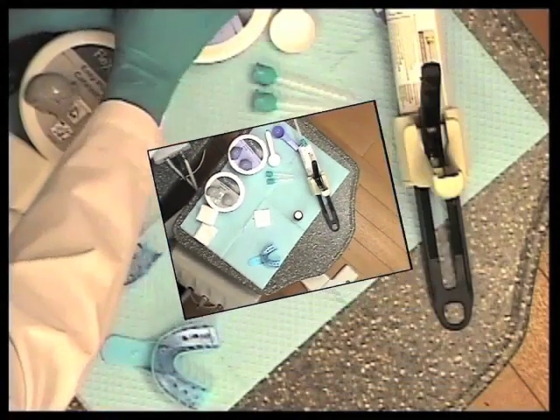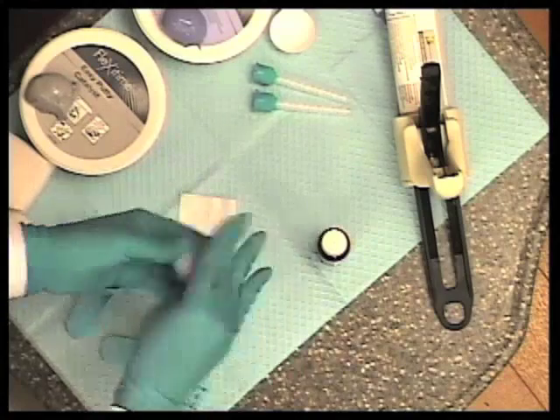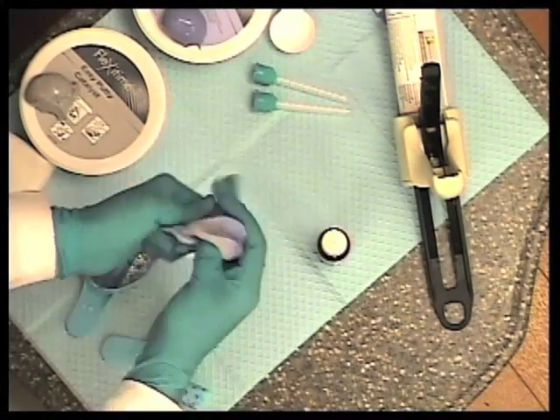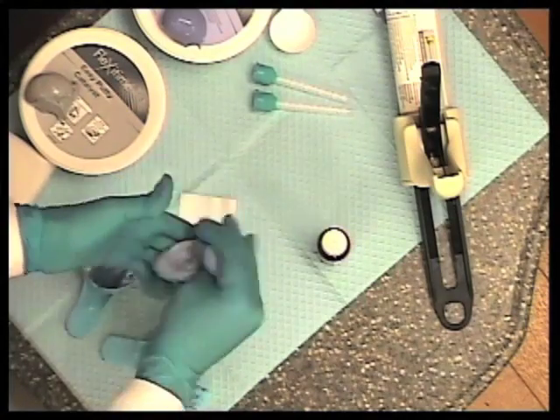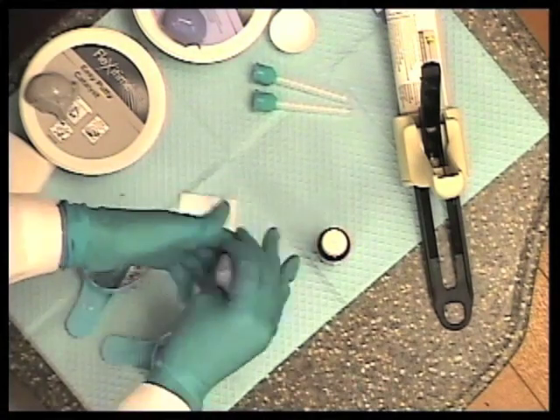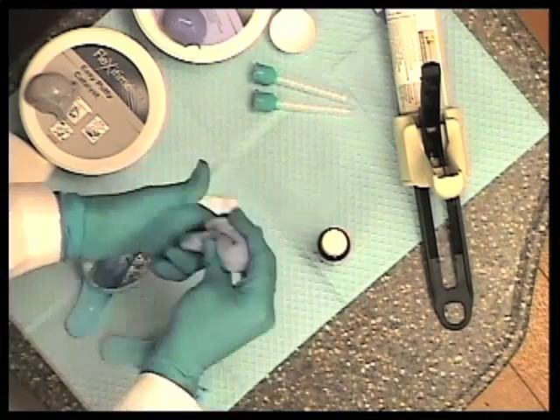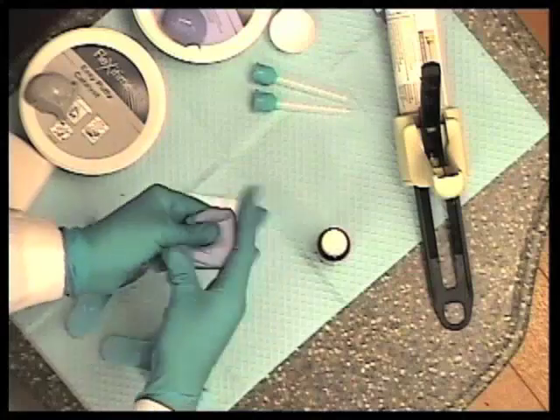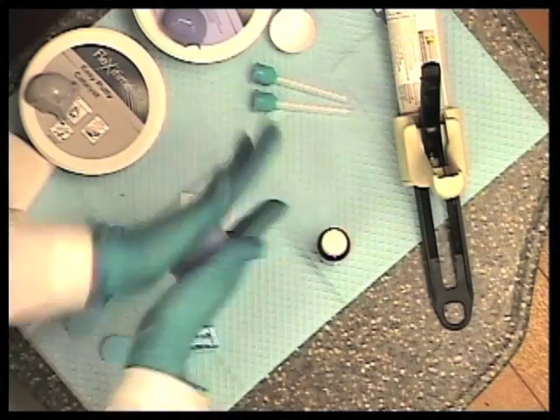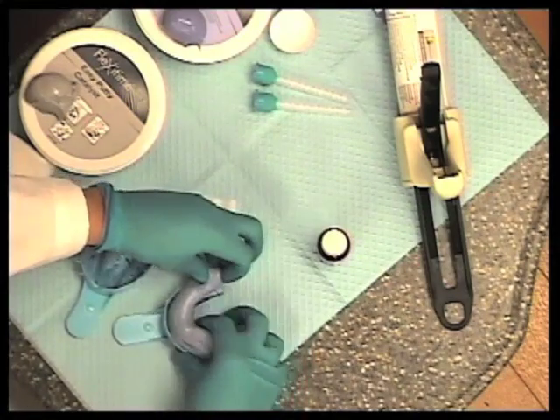Next thing we're going to do is mix the material, and there's a base and catalyst. The most important thing with all of these putties is to mix it with your fingertips and keep it moving. We have different colors so that you can tell when this material is properly adapted. So keep mixing with your fingertips so you no longer see streaks, and that it becomes one uniform color. And then you're going to orient it into like a little hot dog, and you can pick up the tray and get it seated.